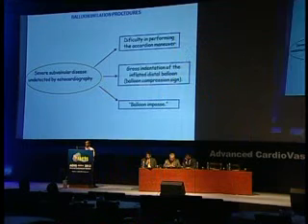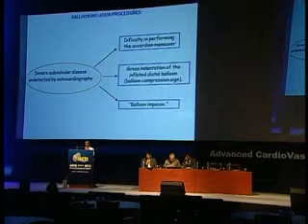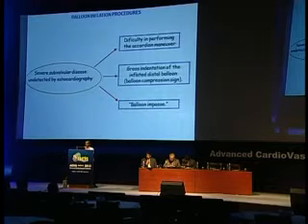Another issue is that whenever the patient has a very severe subvalvular fusion, when you're advancing the balloon catheter across the stenotic mitral valve, sometimes we notice that the balloon enters the funnel, but when you push the catheter, it makes very slow progression, and sometimes we may not be able to reach the apex. As you find it difficult to access the LV, you may be in a hurry to inflate the balloon, because with the balloon across and the fall in the pressures, you may try to inflate the balloon and you can end up in a disaster.